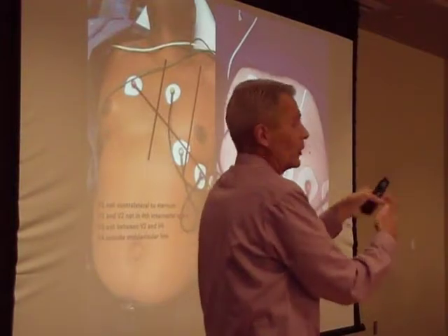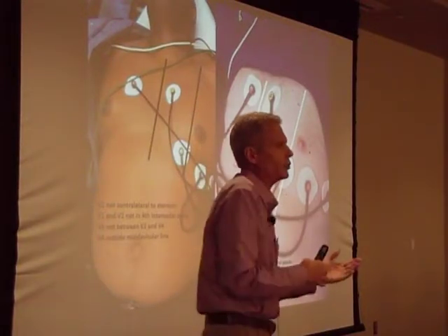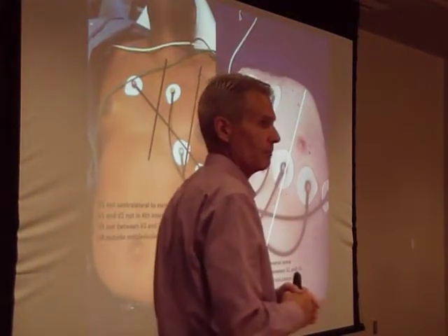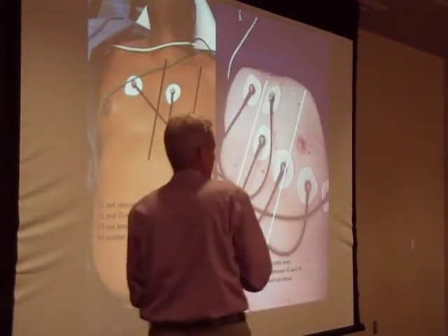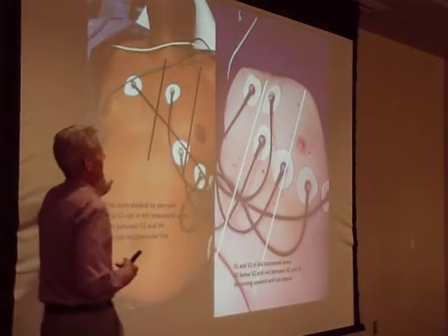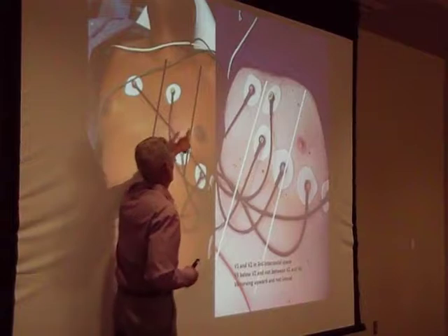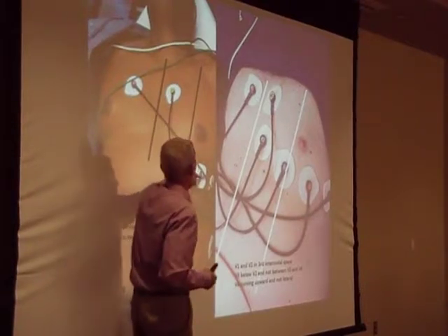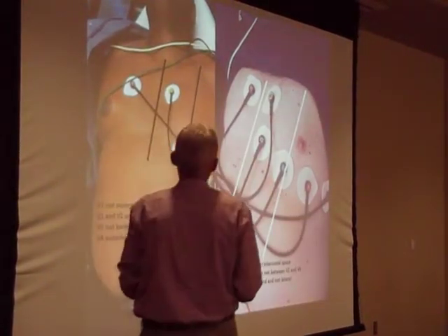Before we started looking at moving to that, we tried a little drill with some of our providers to see how well of a job they did with putting patches on a patient's chest. So we brought in models, males as well as females. They bared their chest. We had the providers put on the patches like they normally would in the field, and this is what we found. Look at our guy on the left here. Here's the sternum. V1 and V2 are supposed to be along the sternal borders. You know that V1 is out of position. And then when you look at V2 through V4, we know that V3 is supposed to be between V2 and V4. Is it here? It is not.